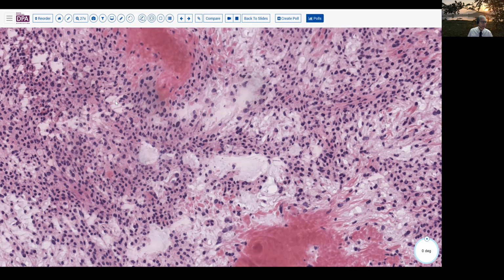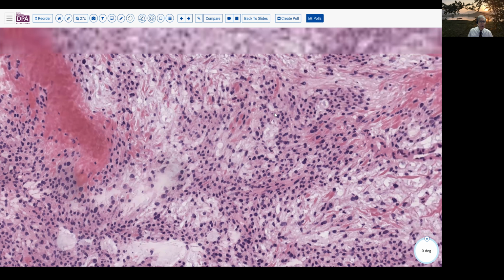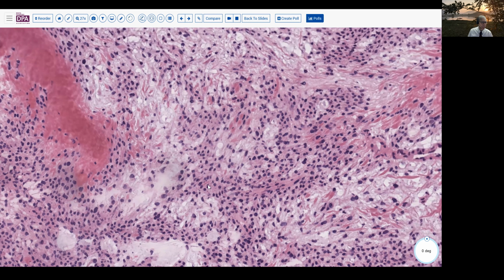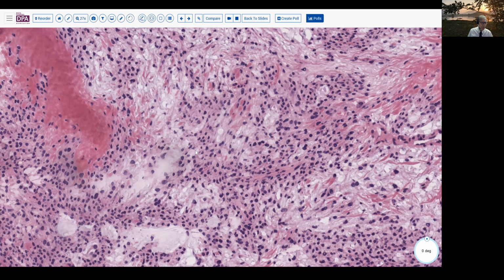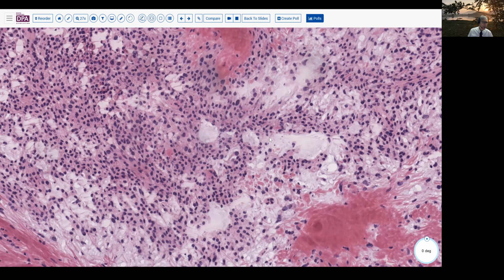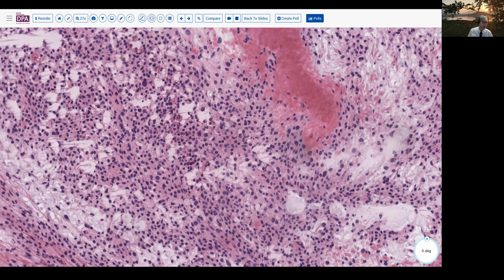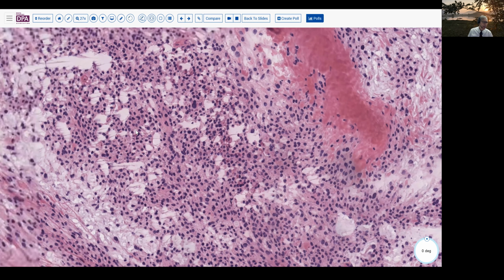Didn't have the classic follicles of granulosa cell tumor or any evidence of tubule formation other than these microcystic spaces. So although it appeared to be relatively low grade, we couldn't exclude some of those potentially more serious lesions. And we said low-grade stromal type tumor, question sex cord stromal origin.